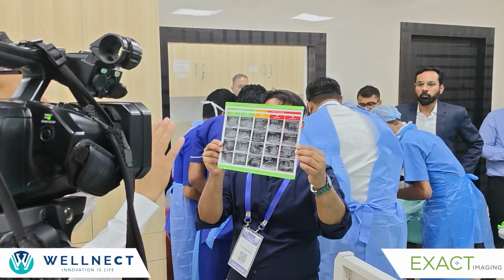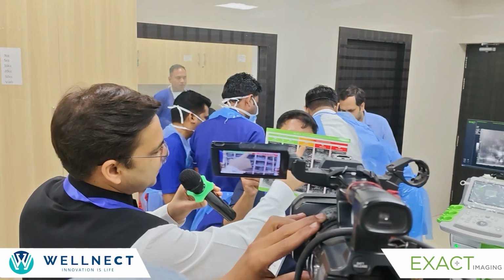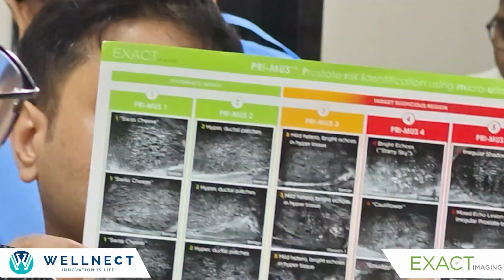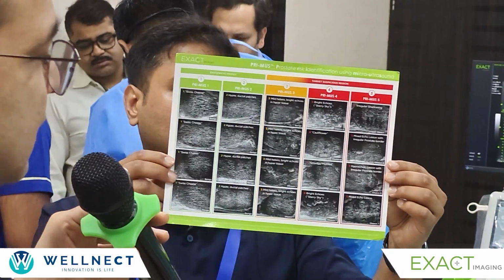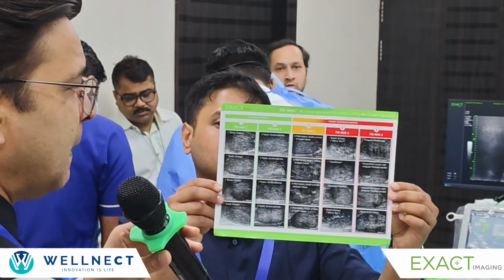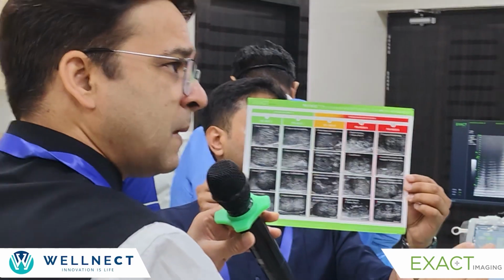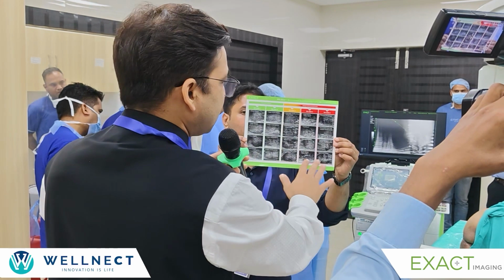You can just have a brief idea. You know all PRIMUS 1, 2, 3, 4, 5. So PRIMUS 3 is equivocal. PRIMUS 1, 2 doesn't require a biopsy. PRIMUS 4 and 5 require a biopsy. This is a staging based on this high frequency ultrasound in literature. When we studied the literature, I think it was probably proposed by Dr. Lawrence Scotts, and he has done a lot of cases and he has proposed this grading.